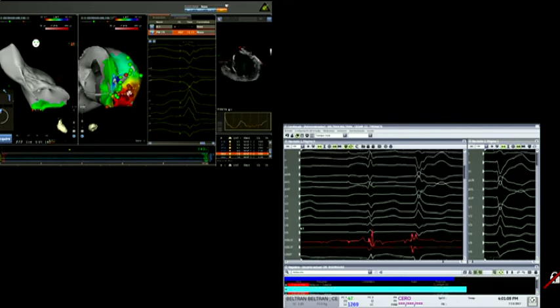you can see on the polygraph the Purkinje potential. In the sinus rhythm, you can see the Purkinje potential after the initiation of the QRS. And then in extrasystole, you can see the Purkinje potential advancing and making a change in the unipolar potential, as you see in white. This is the area of origin of the extrasystole, which in the end, when we did the ablation, that Purkinje potential was eliminated. Are there any questions or comments?